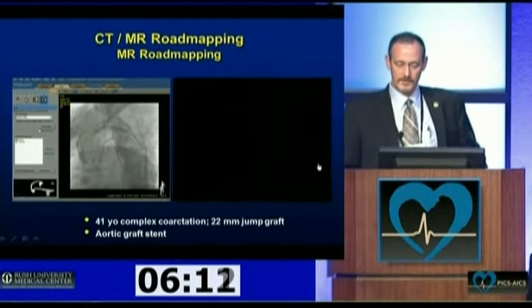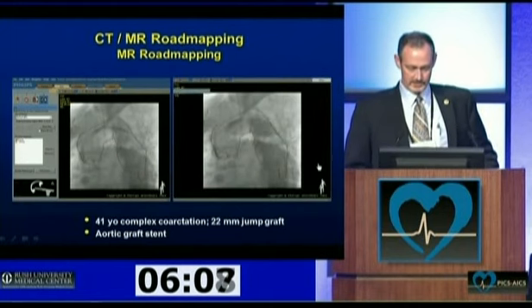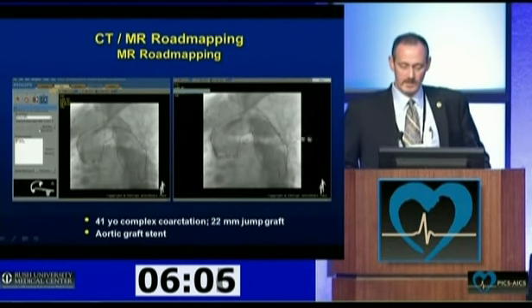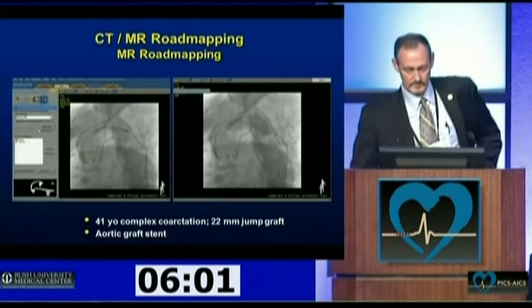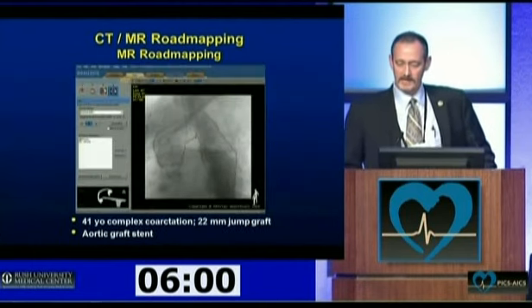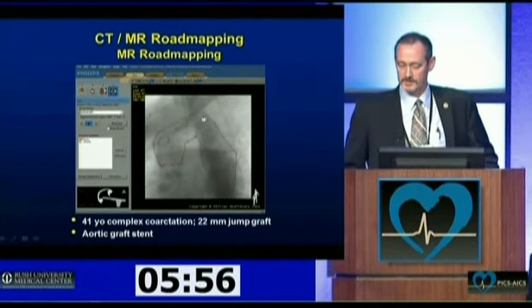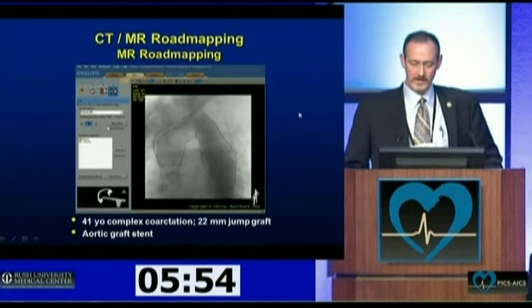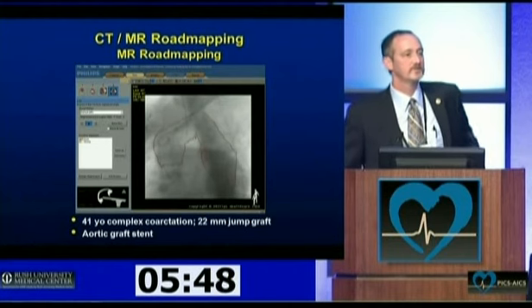That's shown here with the unsheathing of the stent across this extremely kinked portion of the conduit, and then stent delivery on the right panel. Final angiogram shows good apposition in both the proximal and distal parts. There's a bit in the more anterior portion of this conduit where the stent's not in apposition, but the stent was in proper position and opening the graft as much as we needed it to.